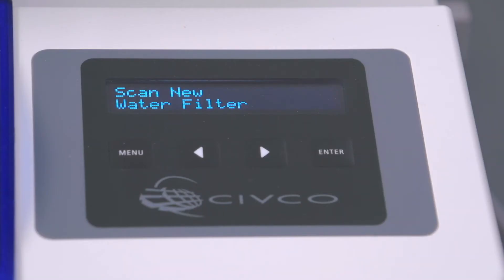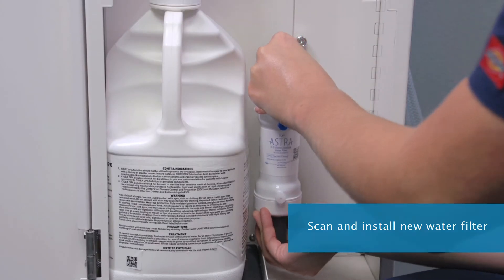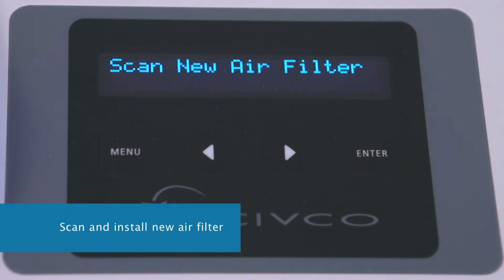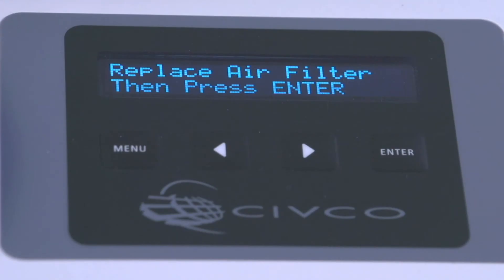Pressing Enter will prompt you to scan your ID, and then you will scan the new water filter. Install the new water filter once scanned, then press Enter on the screen, followed by scanning the new air filter. Install the new air filter once scanned, then press Enter on the screen.